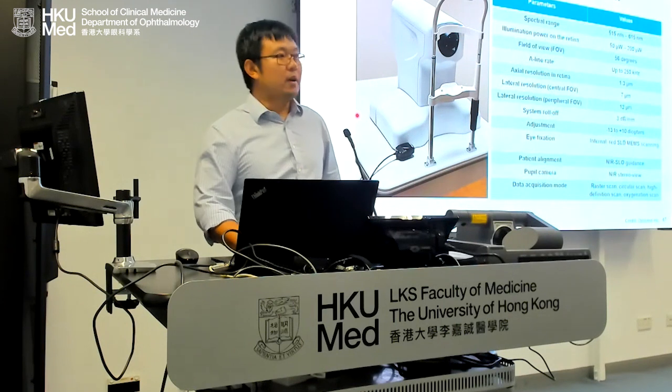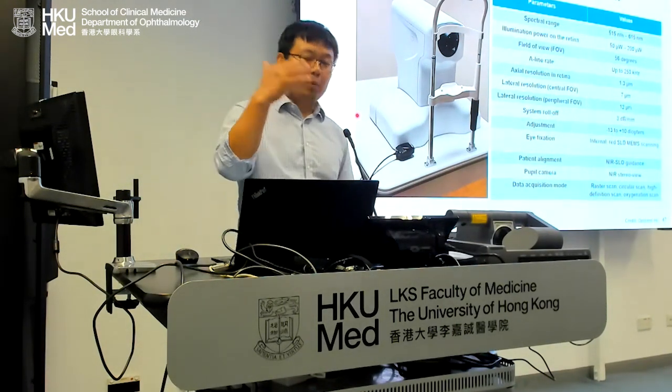clinical study using the OCT, because we deal with the engineering part. This is another image, the fundus image. And with the balanced detection, you can see the quality is just much better. Again, this is the final machine. Quite a few places have started to work with us to test it. And there will be one here, not necessarily in this building, but at HKU working with Chris.